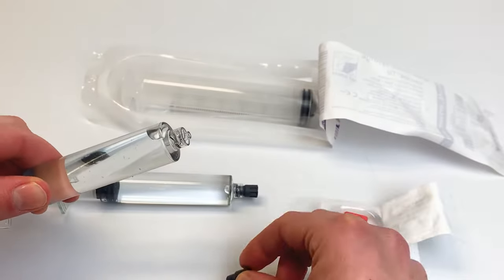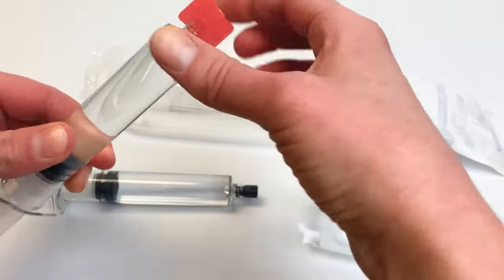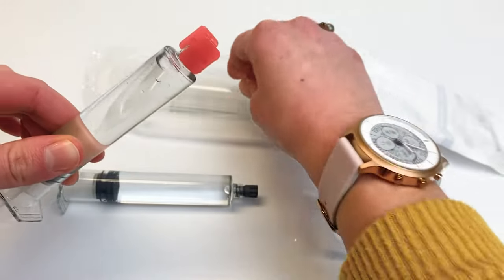With clean hands, remove the cap from the end of the pre-filled syringe and attach the transfer device with care not to touch the open ends.